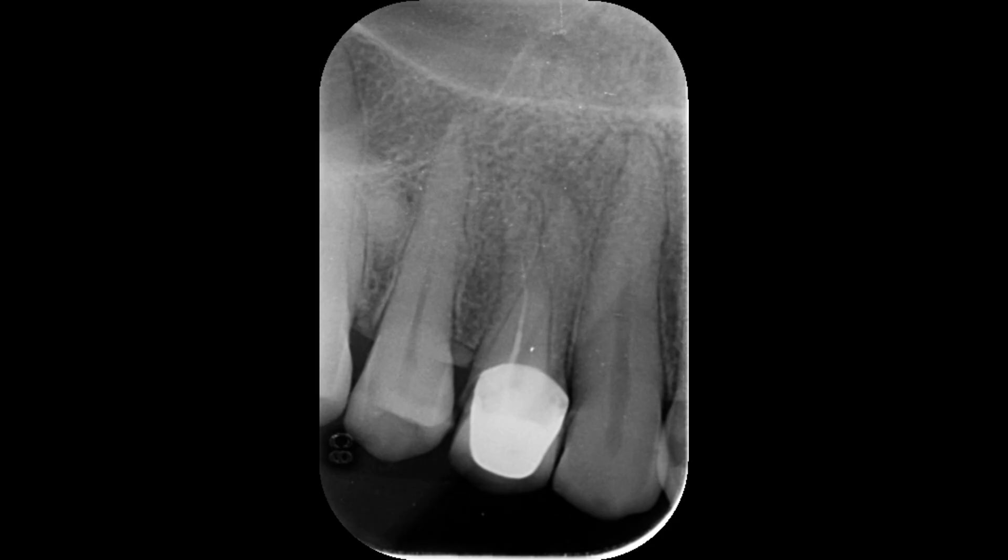Let me show you what I found on the radiograph. This is the pre-operative radiograph where you can see the maxillary first premolar tooth with two roots — this is the buccal root and this is the palatal root. The previous dentist had filled only half of the buccal canal, and the palatal canal is completely untouched.